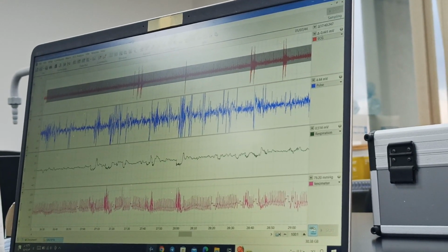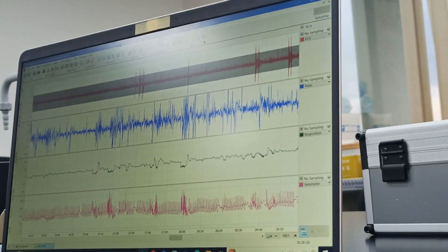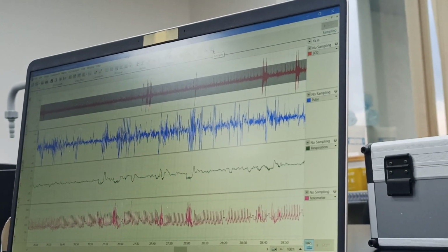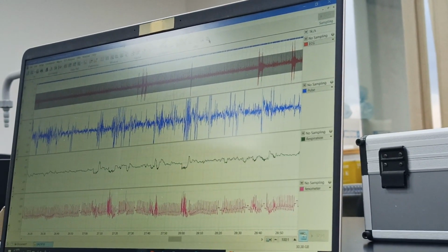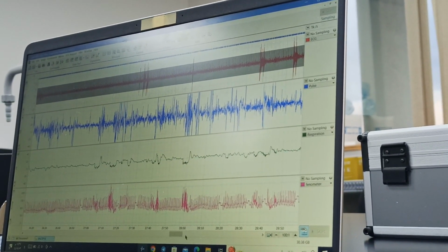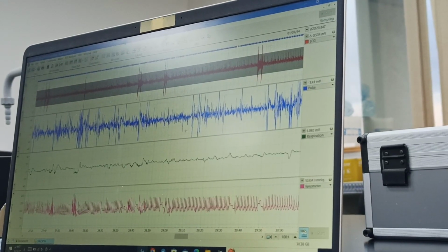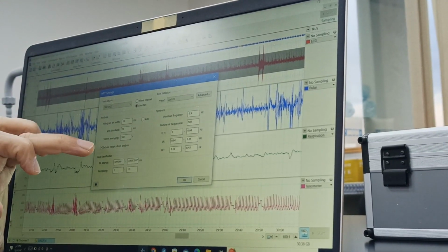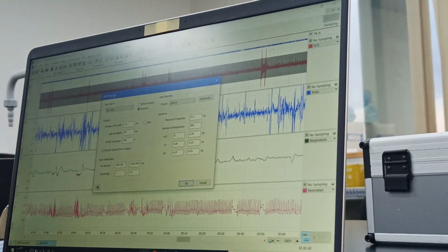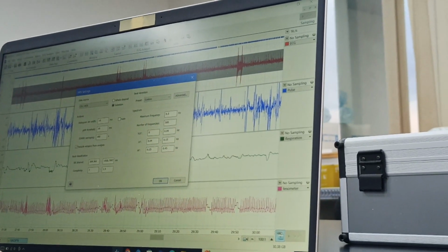And now there are a number of disturbances here. So let us see. This is all during the rest before we start the tilt. Yeah, but this has to be analyzed. So it has done those analyses, more or less. We go to settings and just see that this is ticked as exclude ectopic from analysis. So the program automatically excludes everything.